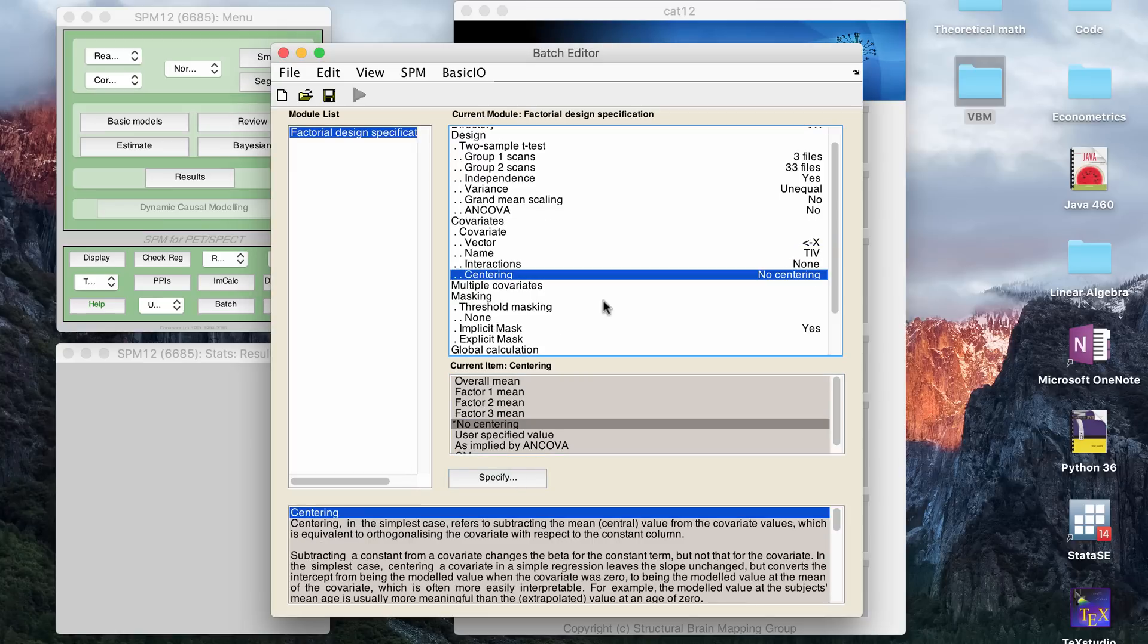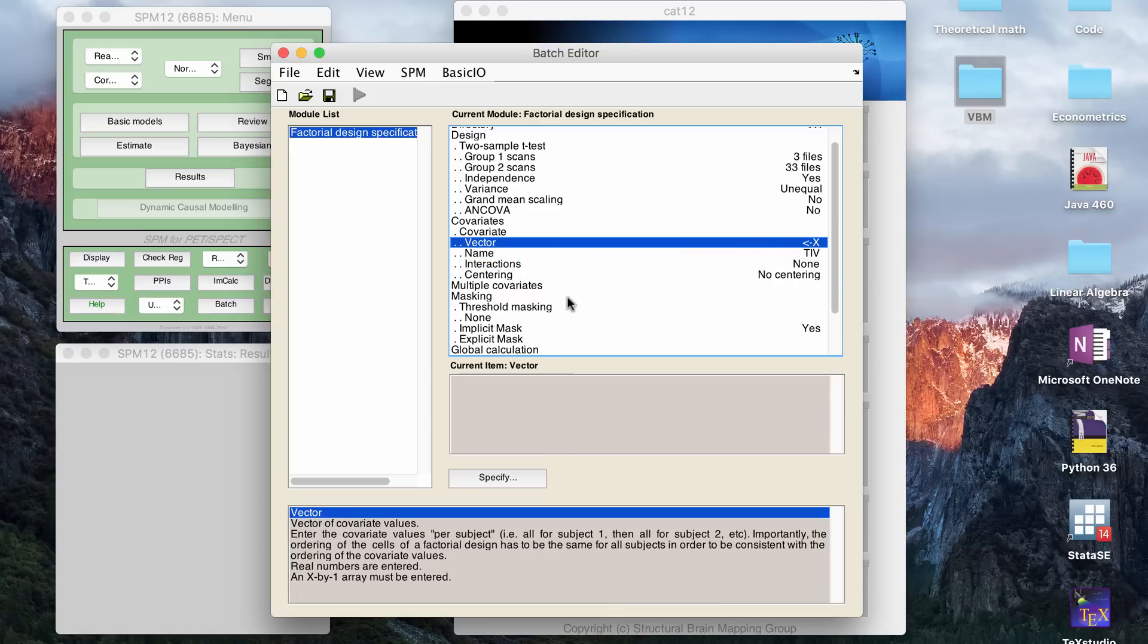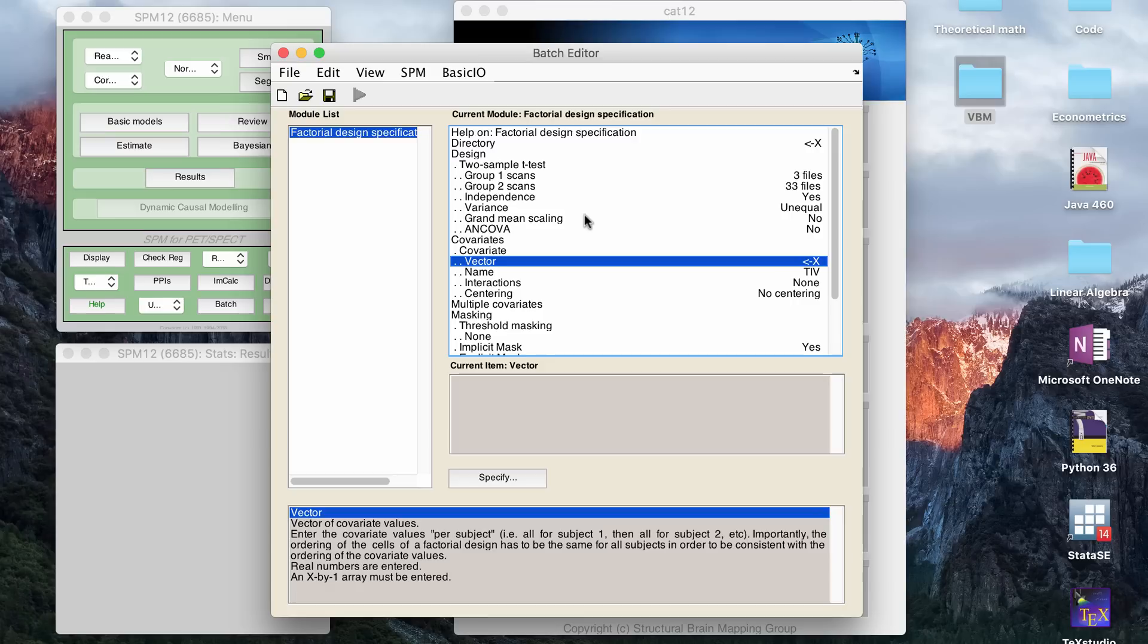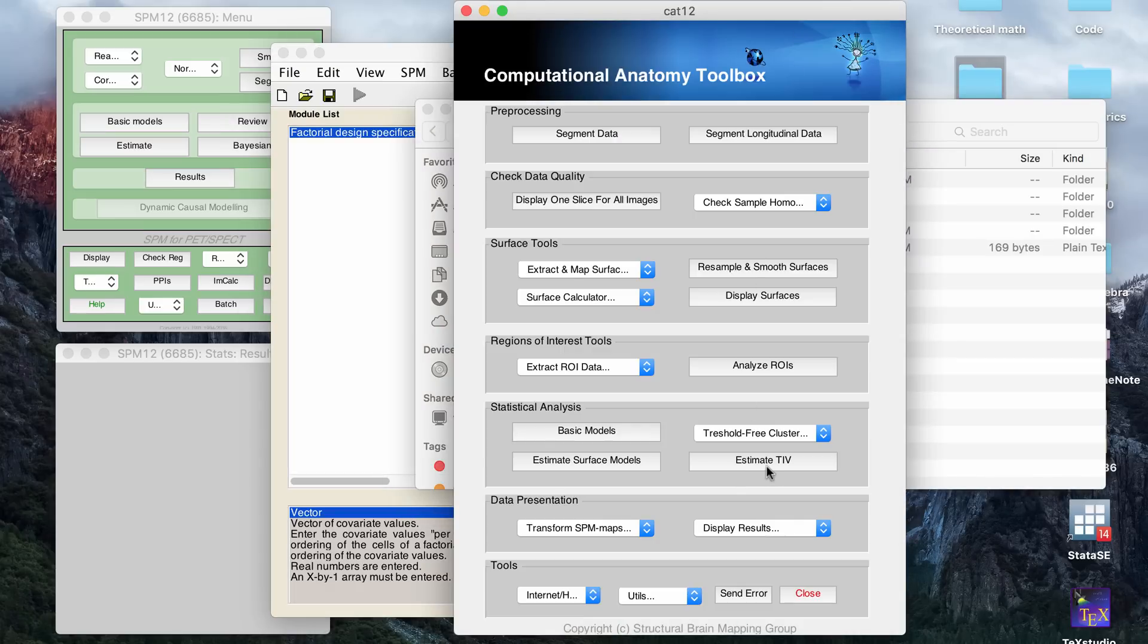So, and it tells you in the manual that you want no centering. And for me, it's going to be no interactions. So it's asking you to input a vector of your covariates. So what you have to do is CAT12 actually has a button that says estimate TIV.